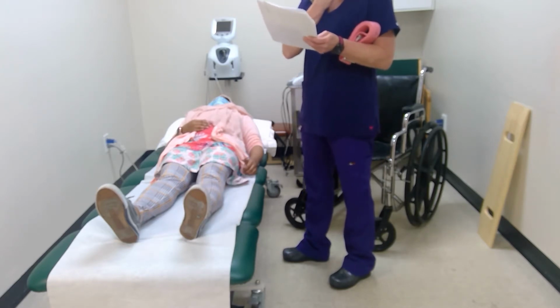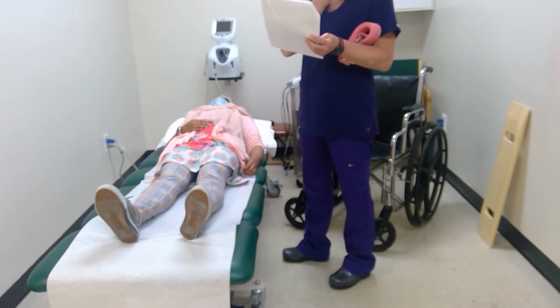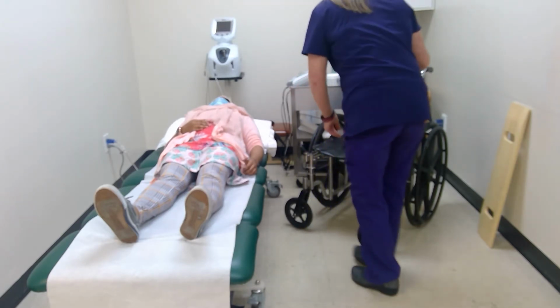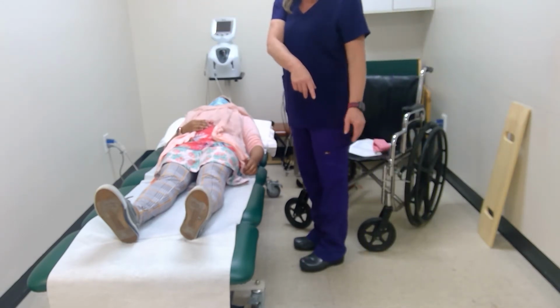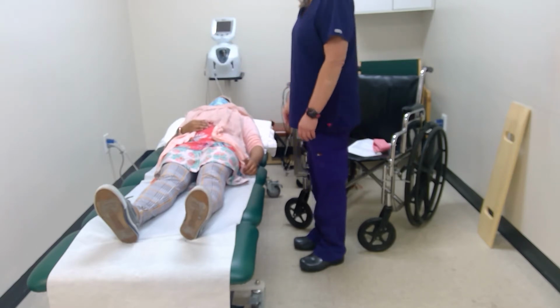She's independent with bed mobility skills, but takes extra time. She performs lateral transfers to and from the bed, wheelchair, and commode with the sliding board with min assist of 1. So before we get started, if I'm going to have her sit up, I would generally bring over the IV pole to this side before we sit up, but I don't have the IV pole.